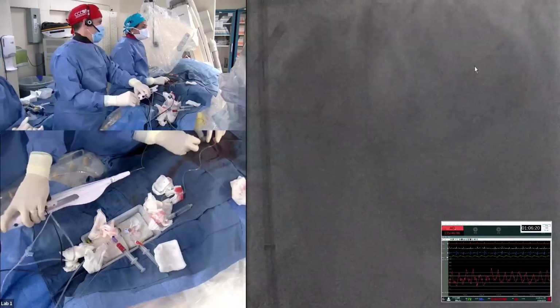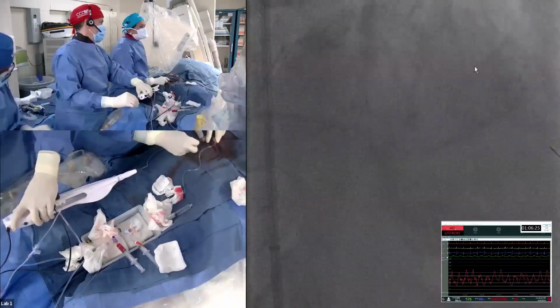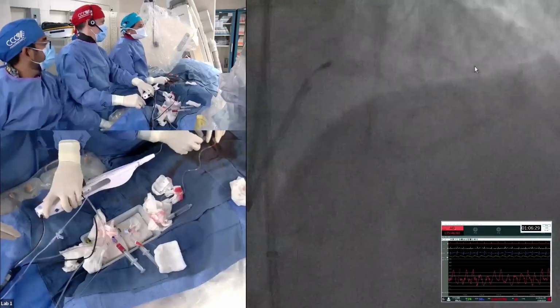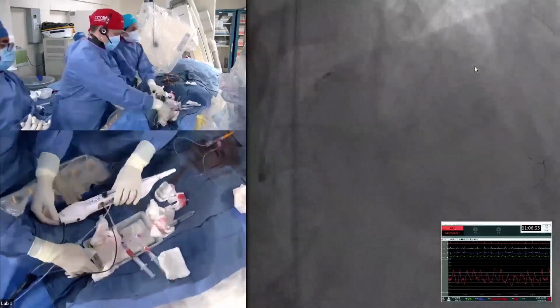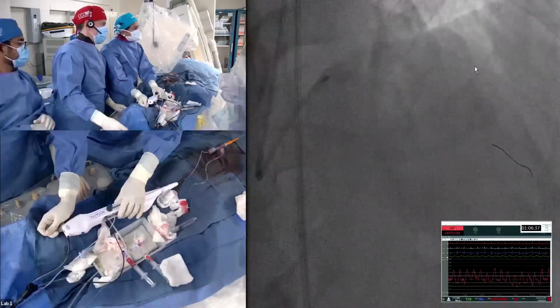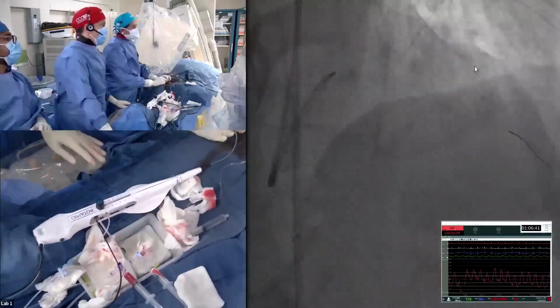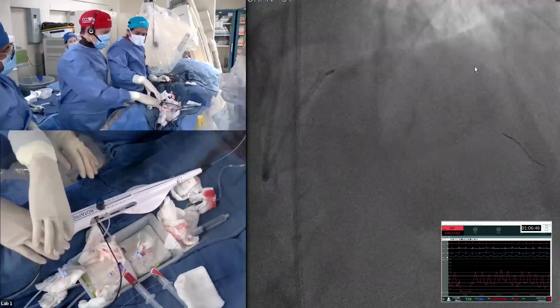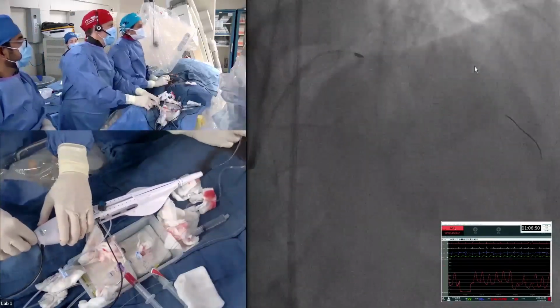No EKG changes. You see that wire pull back. So it's the same size, 1.25 burr going into the diagonal now. And then let's see how it all goes. Let's see if you're going to use the same technique to get it past that big rock of calcium there. Yes, easier. I did all my 3 steps again. Okay, good. And now she'll Dynaglide it again, so you see she's taking the Dynaglide tension off, so it doesn't jump. Yes. Good. Okay, good.